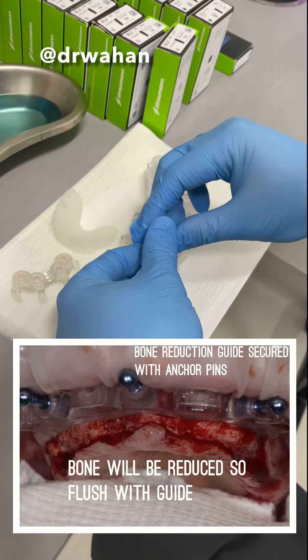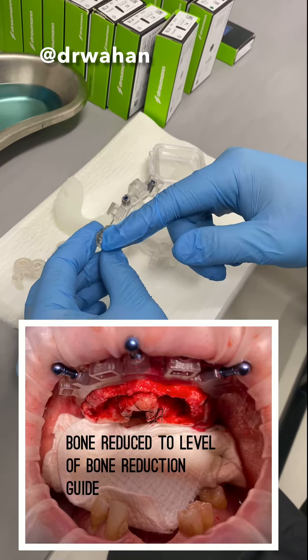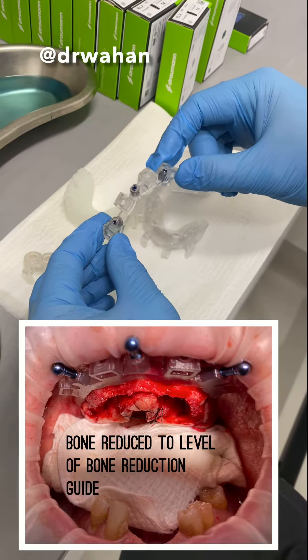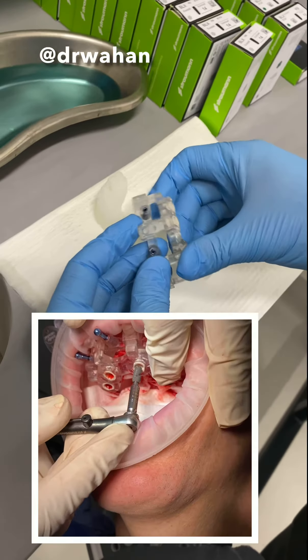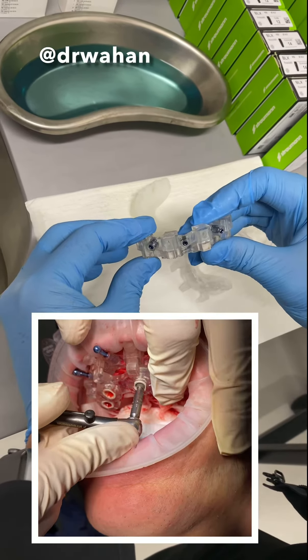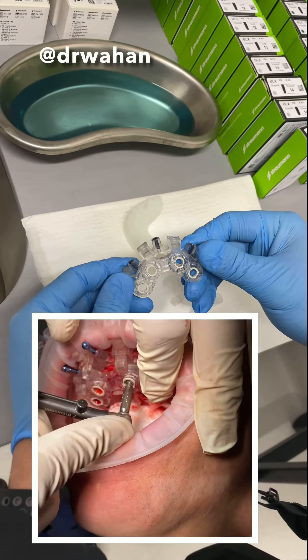And then this will stay in place. This is also the level of the reduction — we reduce down to this reduction guide. And then after the reduction, this is the implant placement guide, which also stacks on top. You put in the four pins and then it's fully guided through here.